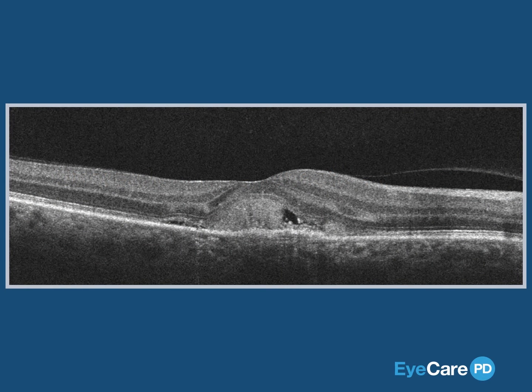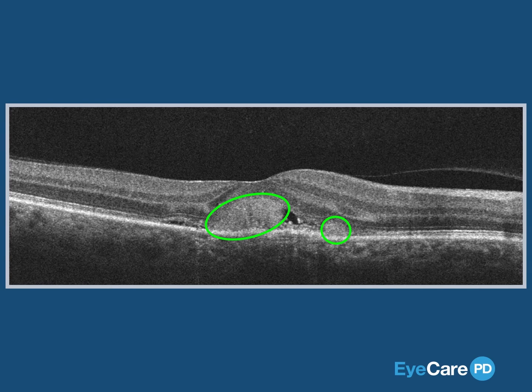Subretinal hyperreflective material, seen here, is a catch term to describe the OCT appearance of one of several examination findings. Most commonly, it represents choroidal neovascular tissue, but at times can be noted with isolated fibrosis, hemorrhage, or lipid.